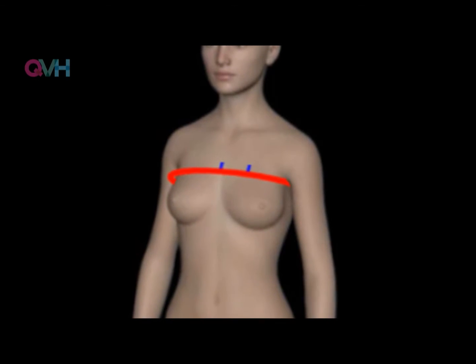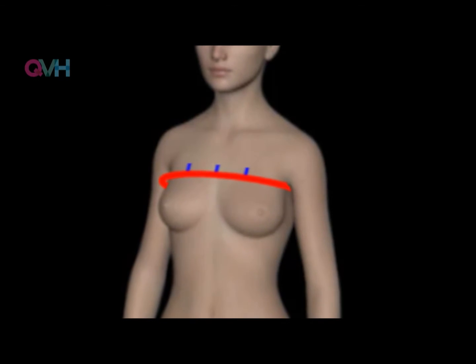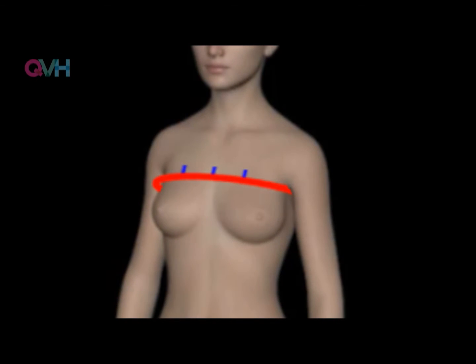And then you also measure either side below the side of the neckline. These marks will show you where to measure from the center of the neckline to that axilla mark for the center of the neck measurement, and from the sides of the neckline to that mark for the two distances that are vital for making a vest pattern.